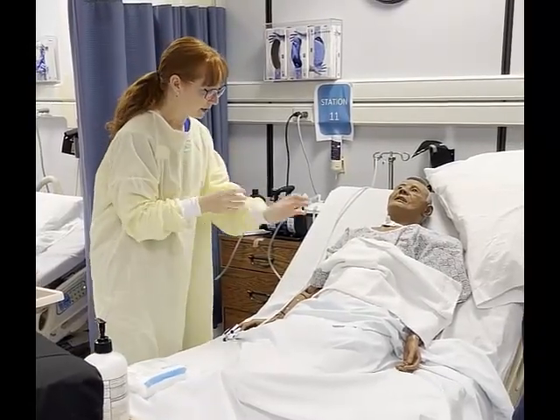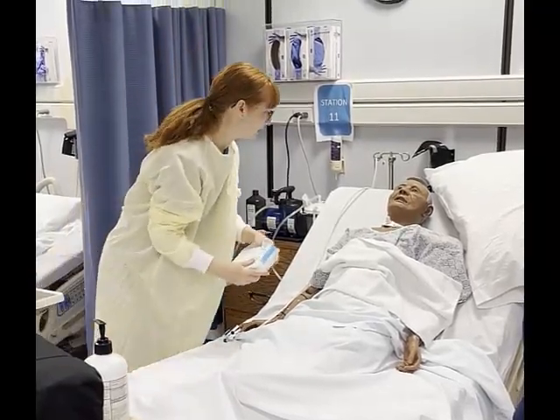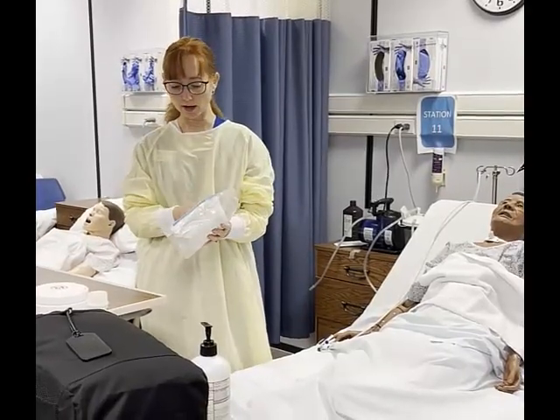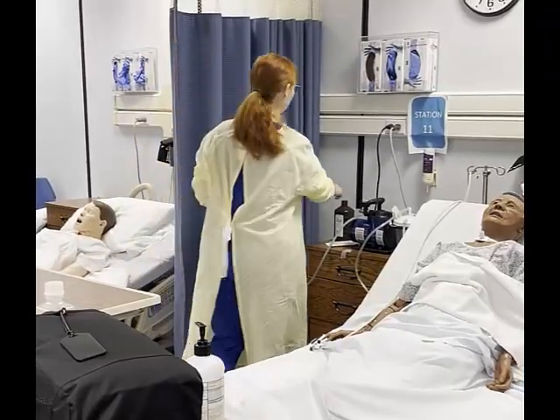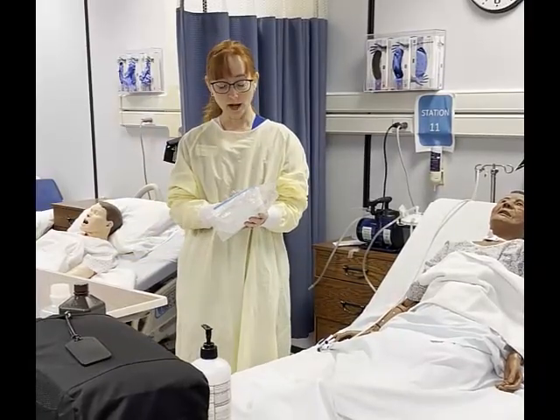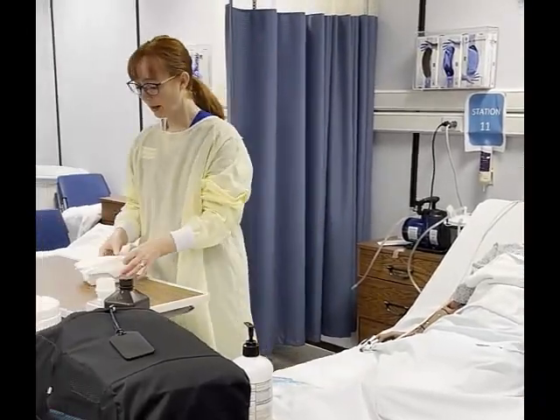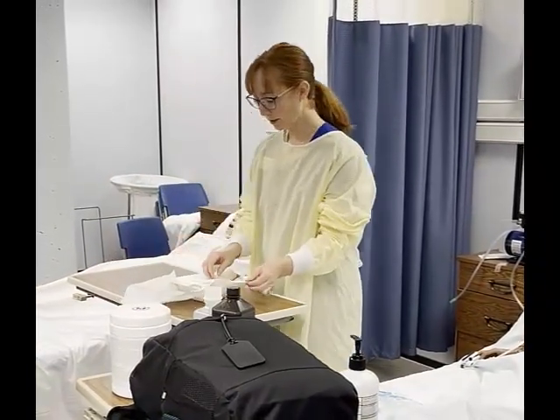Bill, I'm getting ready to do your tracheostomy care. If you need something, just wiggle your left hand so I know you need my attention. I'm looking at my package — checking the expiration date and making sure all contents are present and the package is intact. I'm going to need some saline and hydrogen peroxide. We open the package away from us first, then to the sides.